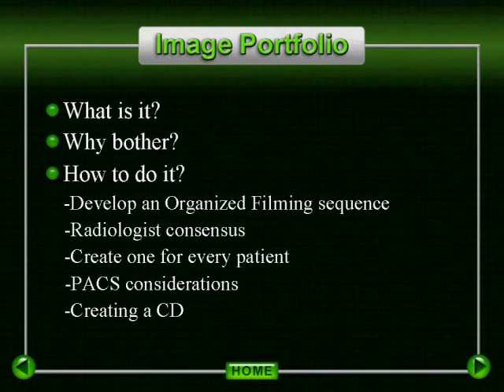Secondly, if you are creating or burning a CD to send with the patient, possibly for outside review or a second opinion, consider what images should be saved on that CD. We would initially burn a CD including all images from the acquisition. We again found out subsequently that individuals reviewing our cases from outside institutions found it very difficult to wade through the large number of images, particularly when they were not familiar with our format.